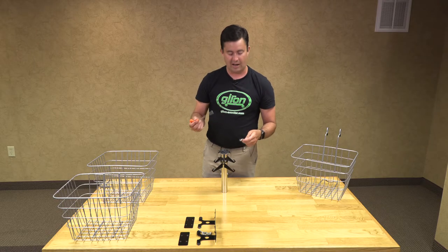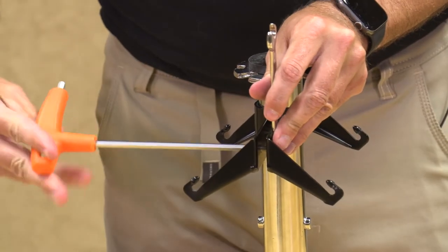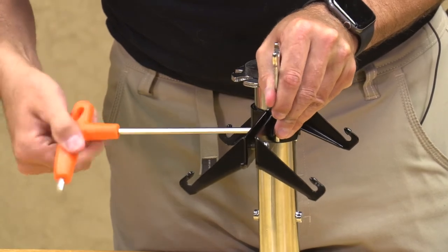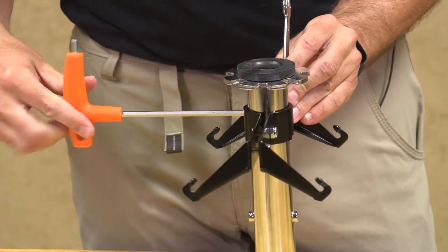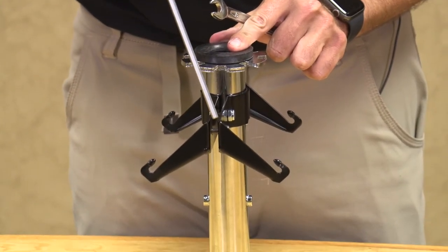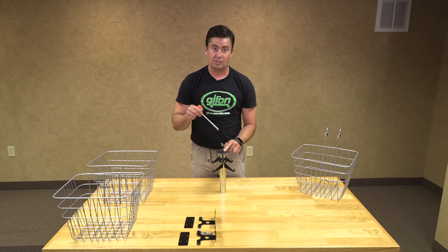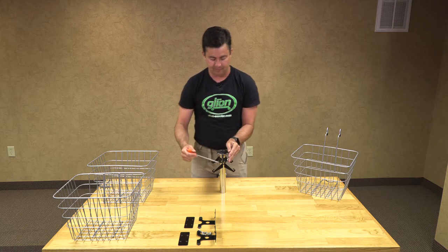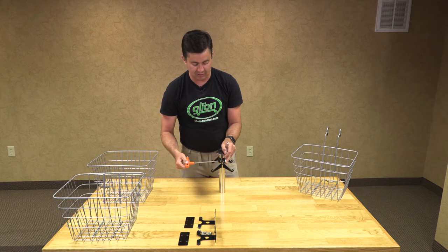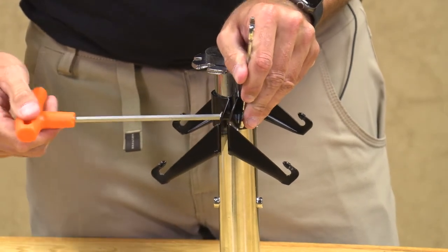Now we will take our end wrench and our Allen wrench, and starting at the front, tighten just a little bit at a time on each of the bolts and nuts. You will notice a small gap in the middle — make sure that gap is even at the front, the middle, and the back, so that the baskets hang neatly. Also be careful not to over-tighten the bolts and nuts, because that will potentially bend the bracket and the baskets will not sit evenly.